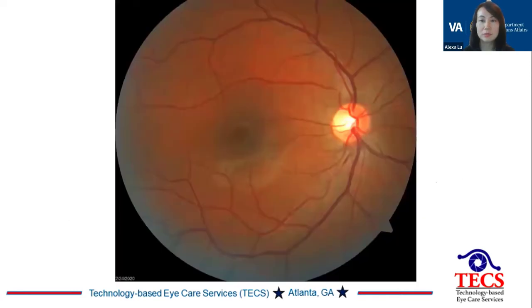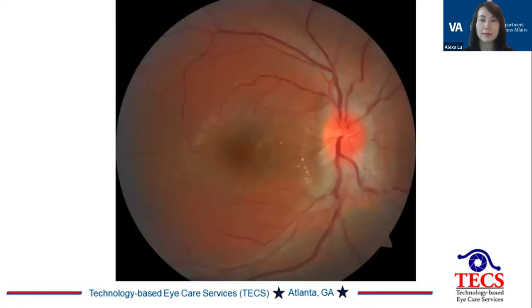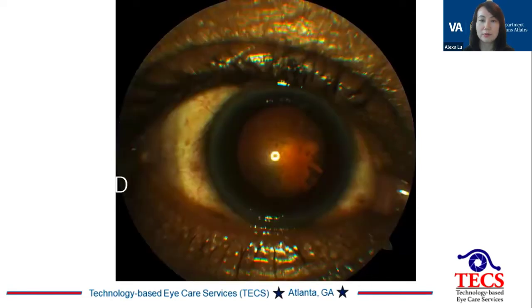We'll start with a normal patient, look at the optic nerve, discuss what we're looking for on the optic nerve, and also what we're looking for in the macula, things that we might find in the vasculature and on the retina. And then we move on to a patient who has more clinical findings, and also, of course, a papilledema patient, because that's something they might be able to pick up with a direct ophthalmoscope. And common eye findings such as cataracts are discussed also.